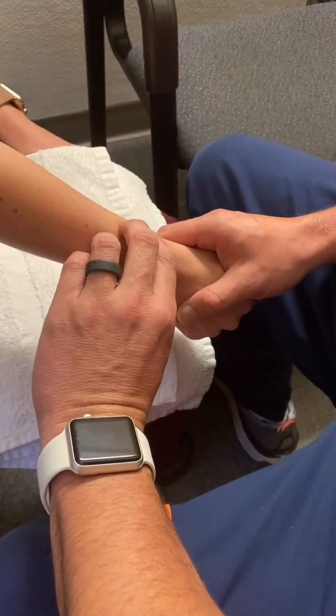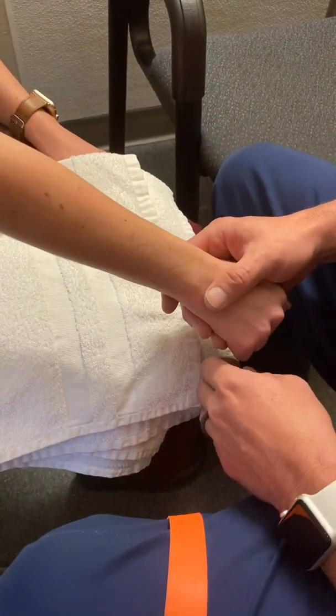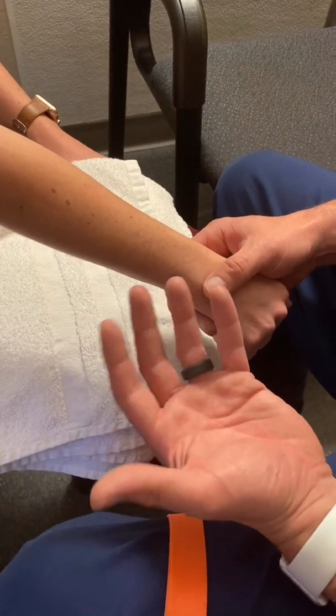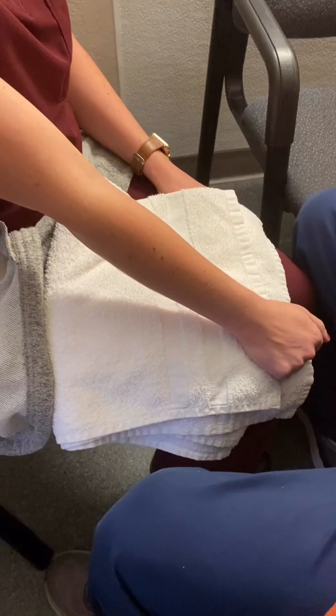And it is a good technique to pick up on because a lot of patients will be dehydrated, or they've had previous drug use, or they could be a child and have very small veins, but you can always feel a vein.